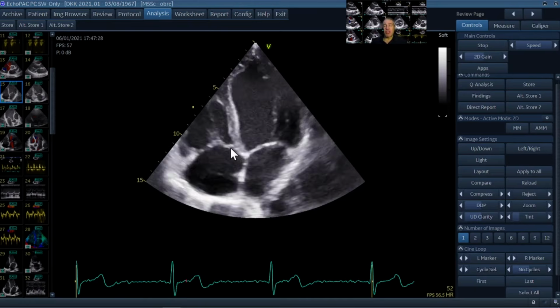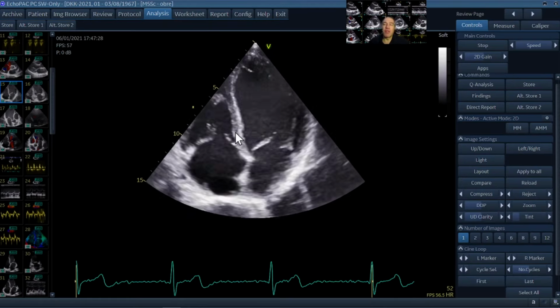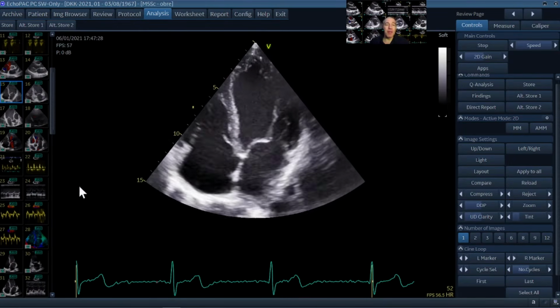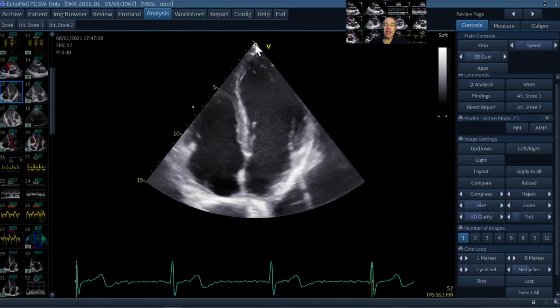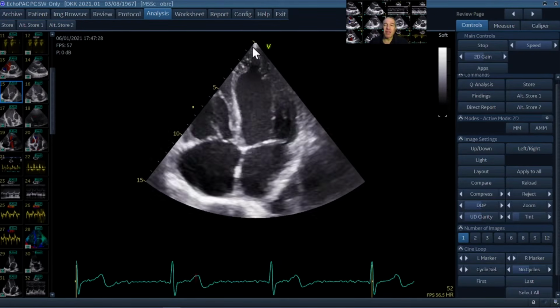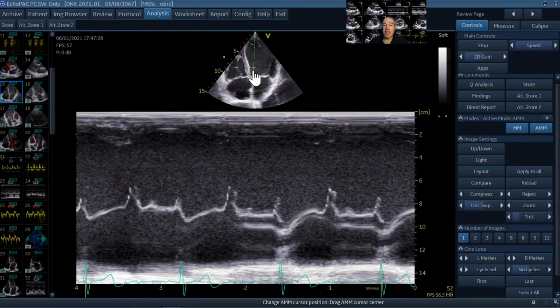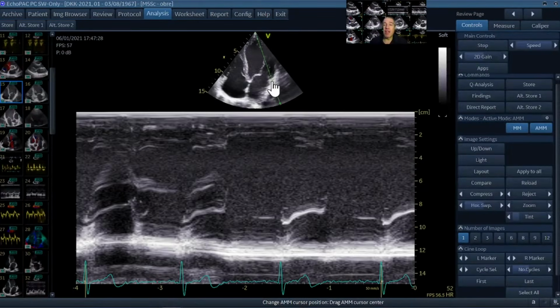There are different approaches how to measure this. In another video I show you how to measure this by left ventricular strain analysis. An easy or a simple method to look at long axis function is to activate a kind of M-mode. So to set a line across the left ventricle at the hinge points of the mitral valve leaflet. I might try to do this here. I can activate here a kind of M-mode, and I place this here at the septal hinge point and at the lateral hinge point.